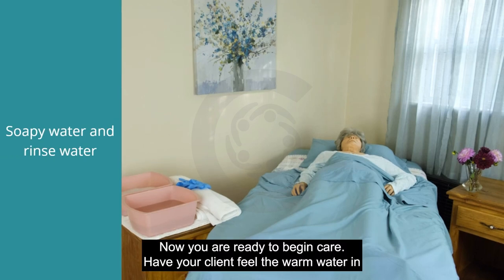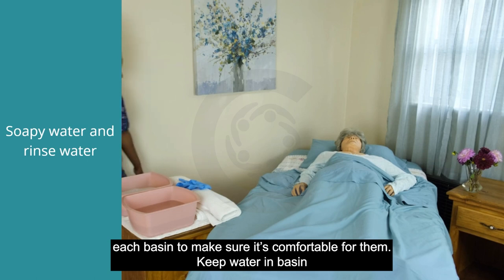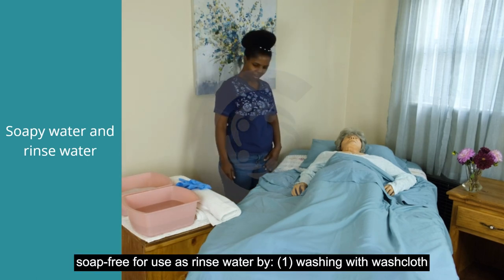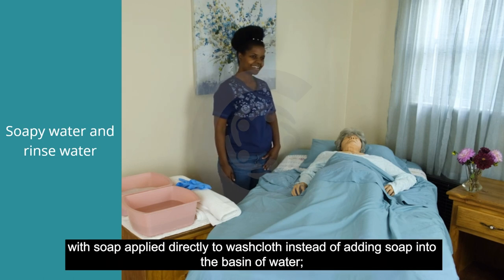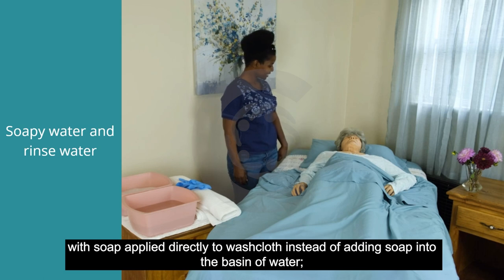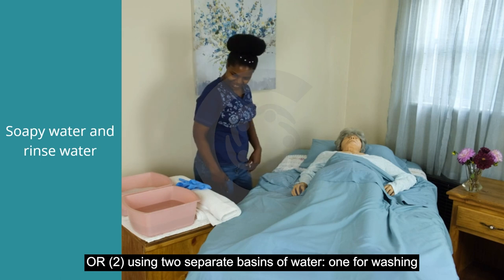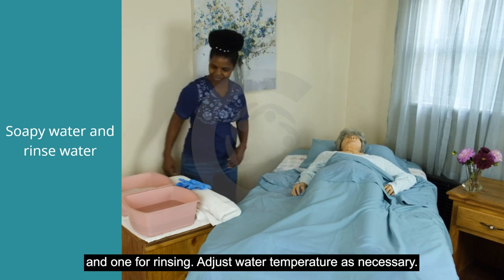Now you are ready to begin care. Have your client feel the warm water in each basin to make sure it's comfortable for them. Keep water in the basin soap-free for use as rinse water by washing with a washcloth with soap applied directly to the washcloth, or by using two separate basins — one for washing and one for rinsing. Adjust water temperature as necessary.